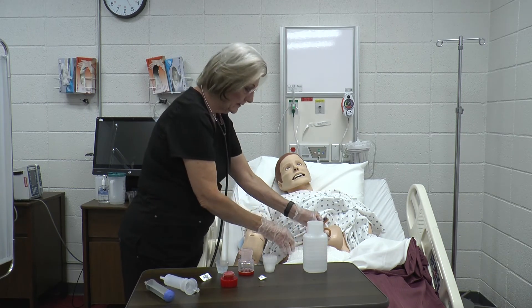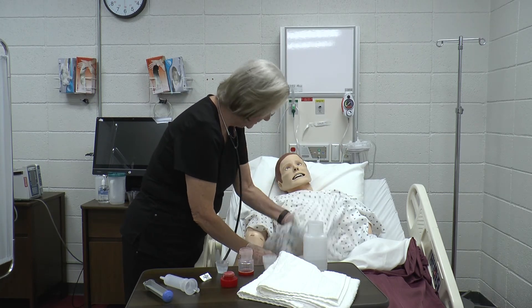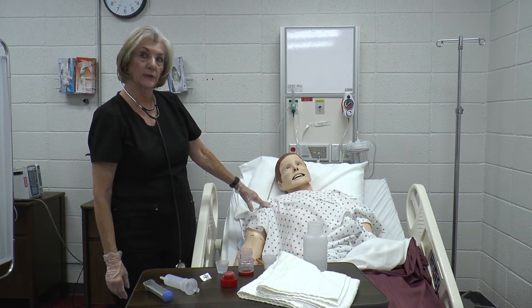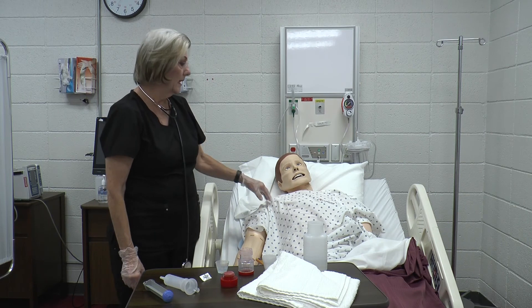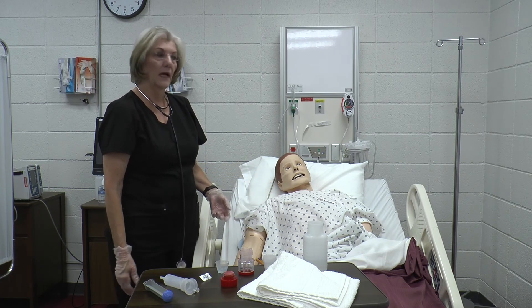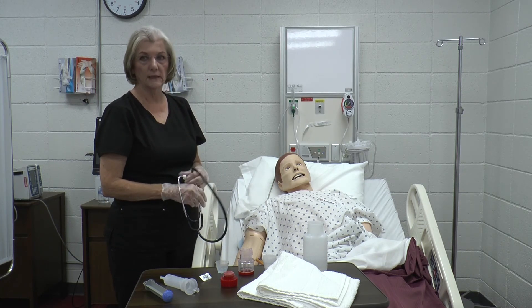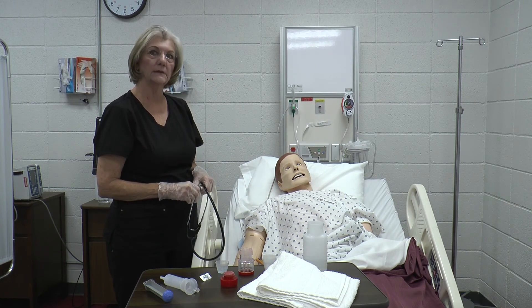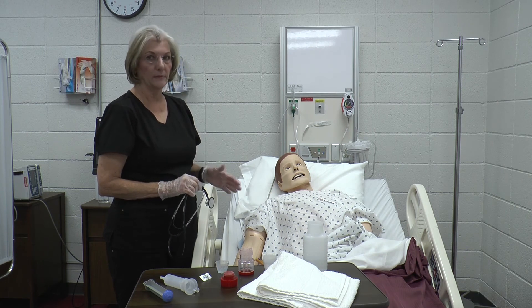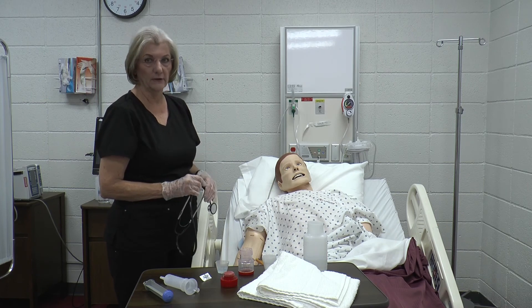You would clamp it, clean up your mess, and make them comfortable. He happens to be at 30 degrees, but he needs to be at least 30 degrees up. He needs to be up for at least 30 minutes to an hour. If you're going to hook him back to feeding or suction, which sometimes happens, they need to not be hooked up for 30 minutes to an hour — so he needs to be up for 30 minutes before you can hook him back to a feeding.